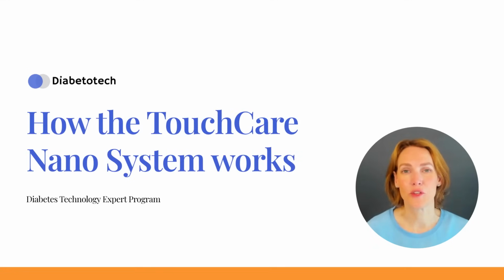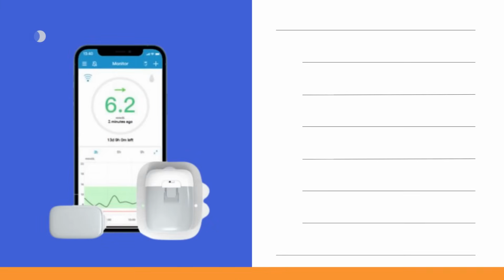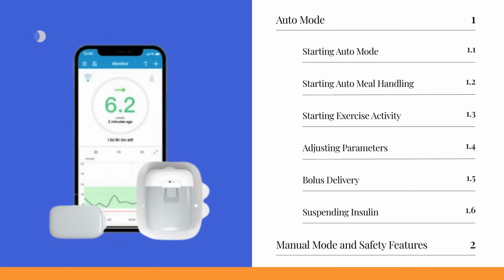Welcome to this lesson on the functionality of the TouchCare Nano System. In this guide, we will explore how to use the TouchCare Nano System's features in both auto mode and manual mode, both on the PDM and on the EasyPatch app.